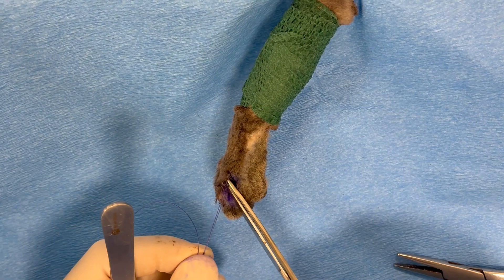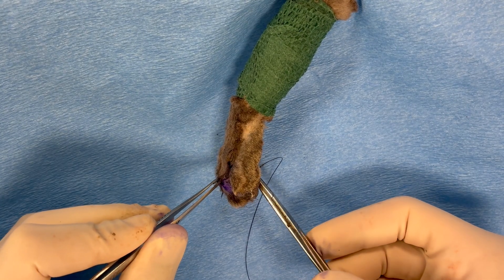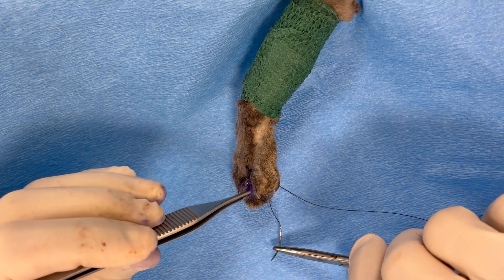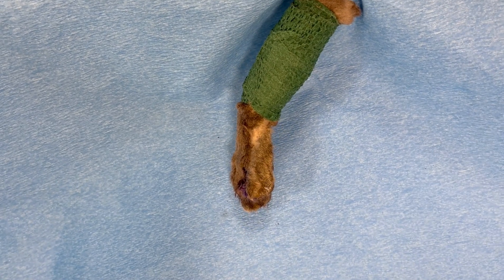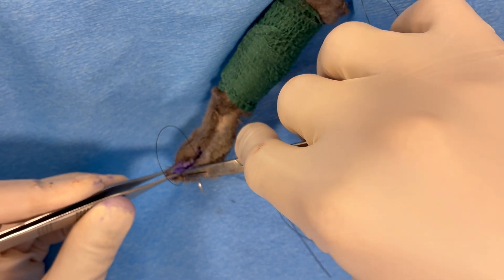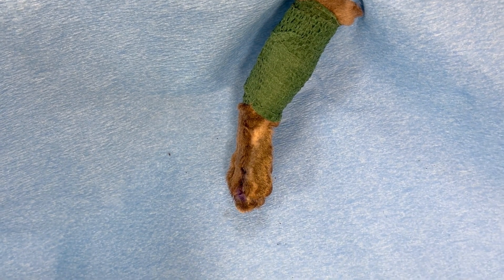With the subcutaneous tissue well opposed, we are now suturing the palmar skin — a little bit difficult to see. These are regular skin sutures using 3-0 nylon. This is a more distal palmar interrupted suture, and that completes the palmar apposition.